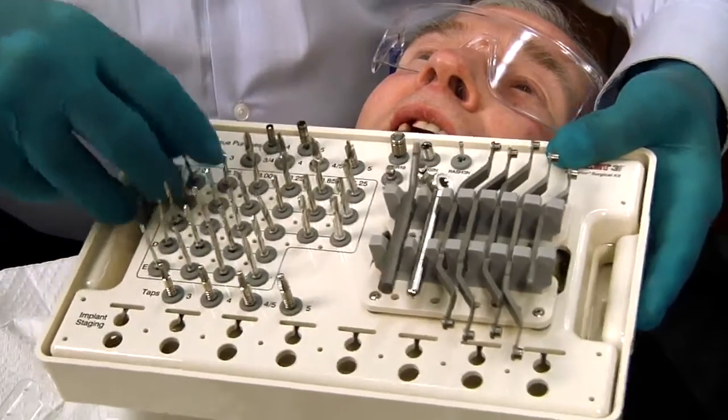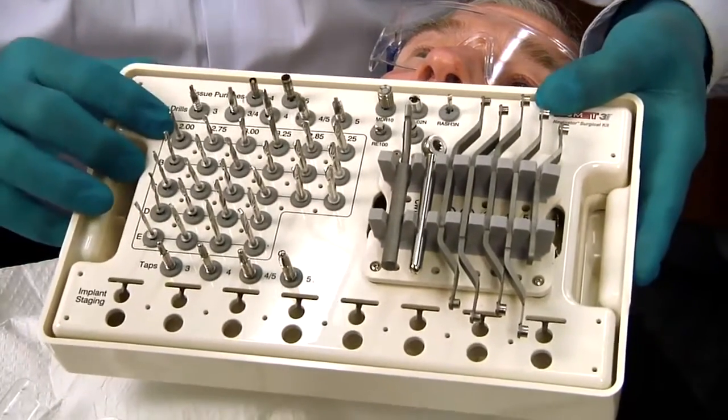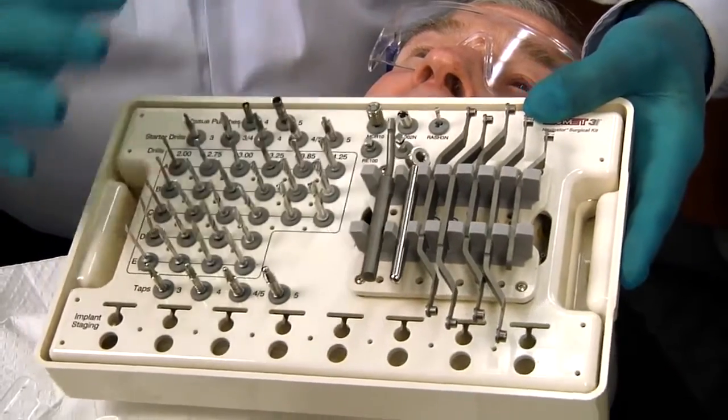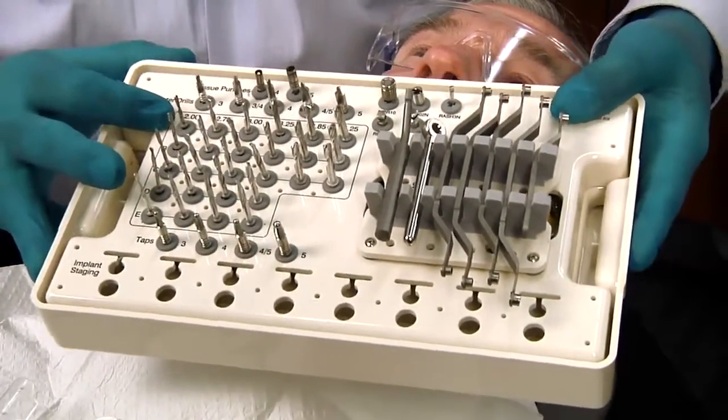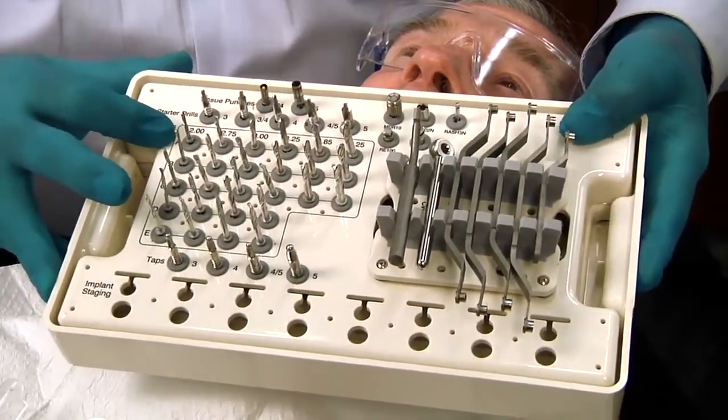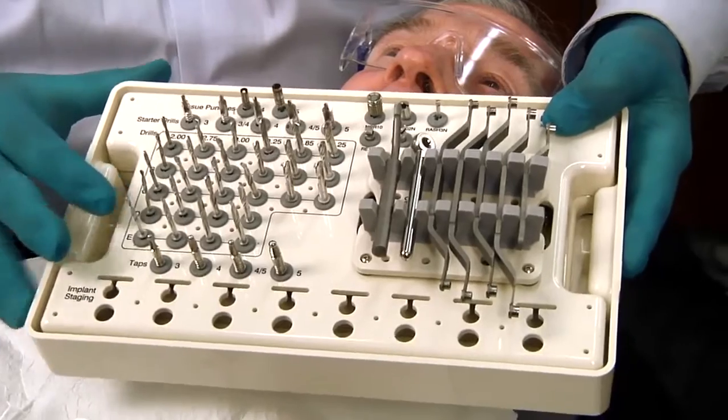As you can see, the drills come in 20, 275, 30, 325, 385, and 425. Additionally, they come in specific lengths which they designate by A, B, C, D, and E.